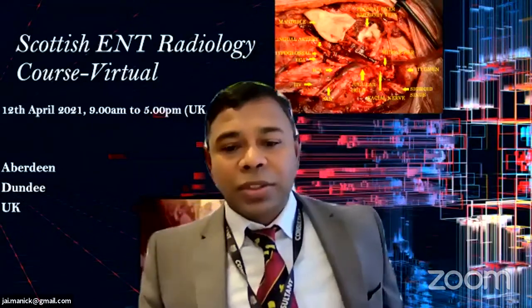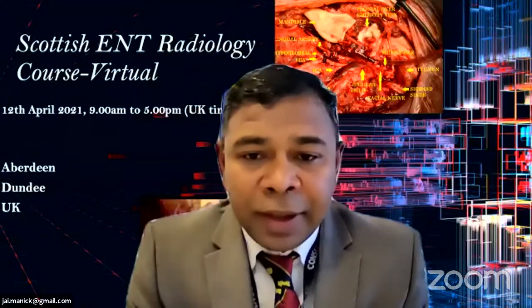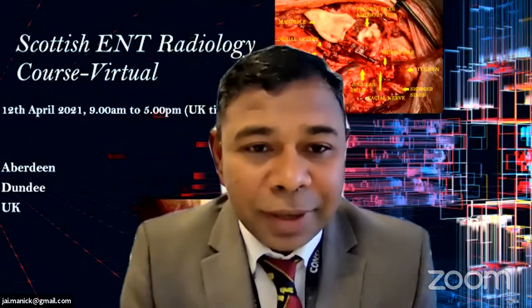How do you distinguish the lymph nodes from the surrounding structures? The lymph nodes, especially cancer lymph nodes, enhance with the contrast, and also the size of the lymph nodes, particularly the location of the lymph nodes, will give you some guidance. And the best thing is, you don't need to identify the lymph node. Ask your radiologist; they will tell you this is the lymph node. That's what I do.